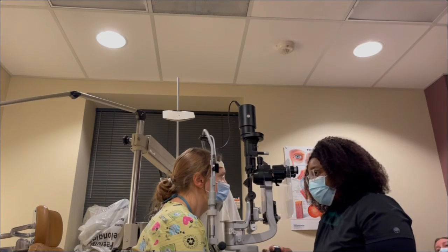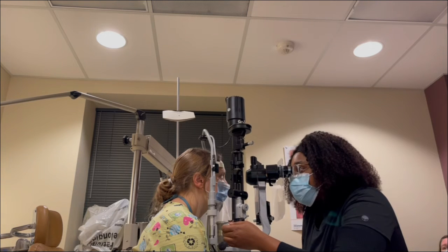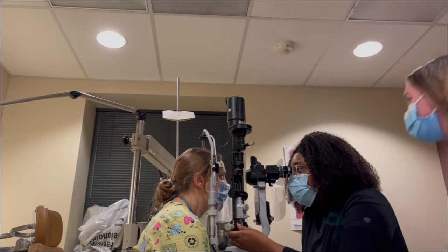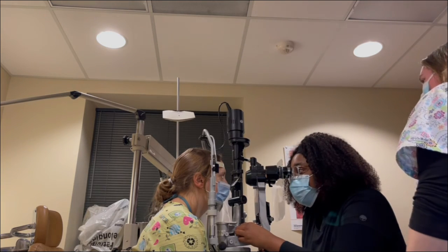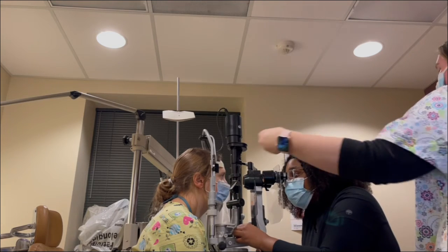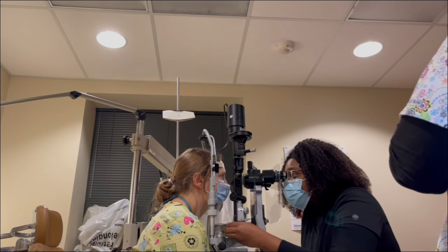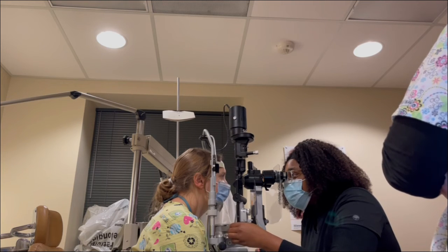I just wanted to talk about a few things with the slit lamp here. The slit lamp can be used to check pupil sizes just like the pupil light — it's actually easier for some people to check pupil sizes with the slit lamp. What I'm doing here is checking her angles to see if they're open. Open angles basically mean it's okay to dilate the patient. Closed angles or narrow angles mean it's not okay — we'll have to get the doctor to check and make sure, and then they will decide whether to dilate or not. Most of you probably know what dilation is — when they put the eye drops in that makes your pupil super huge, lets all the light in, and it gets really hard to see things up close for about four to six hours. We do dilate most patients, especially diabetic patients and those having issues in the back of their eye.